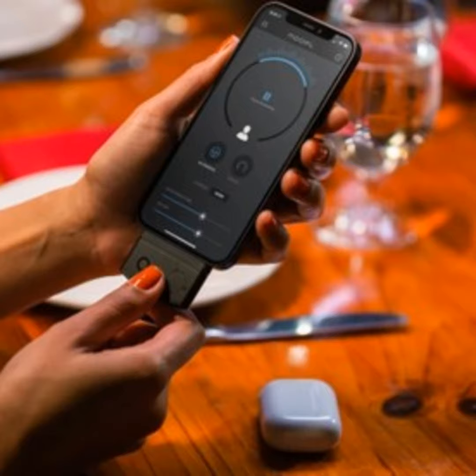Absolutely. There are people who test at an audiologist and their hearing is fine, but they still have that issue of hearing in noise. And there are also people who might already wear a hearing aid or a cochlear implant in their day-to-day life. They still have this same issue of hearing in noise. So we can work with people who have diagnosed hearing loss, but maybe they haven't yet gone to hearing aids. And we also will work with those who use hearing aids. Apple has protocols that were developed with the major hearing aid manufacturers called Made for iPhone. So often we can work with somebody's Made for iPhone hearing aids as a supplement.